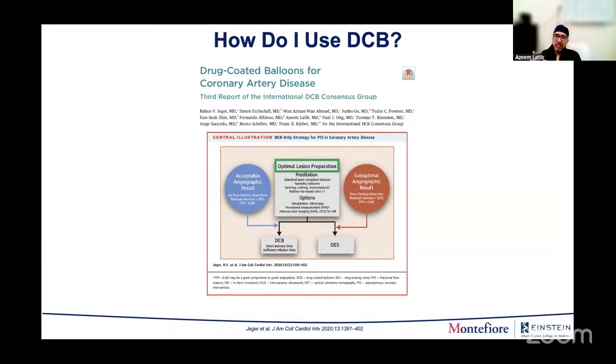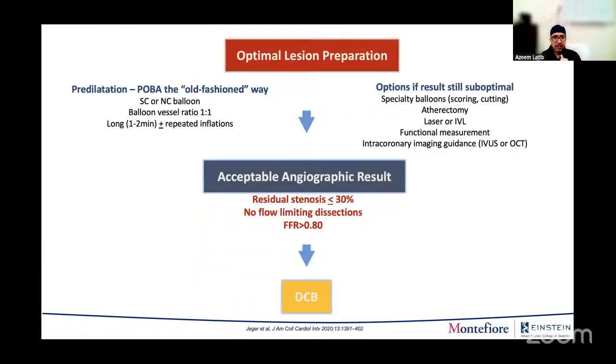When you have cases where you have to do rota as well, those are the times I use drug-coated balloons, and we'll maybe have some examples when I'm doing very diffuse disease and I want to limit the amount of stents. But if it's a focal lesion and I'm doing rota, maybe I'm not using a drug-coated balloon. So let me see the next slide, Pierre.